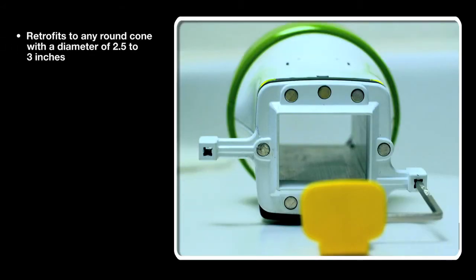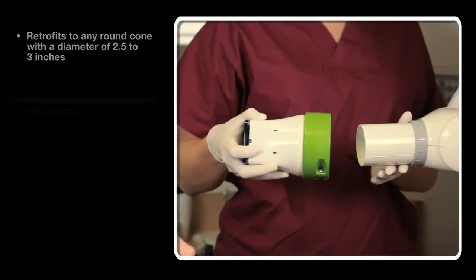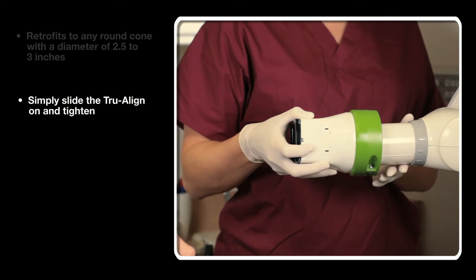TruAlign retrofits to any round cone with a diameter of 2.5 to 3 inches. There's no need to remove the existing cone. Simply slide the TruAlign on and tighten. It literally installs in seconds.